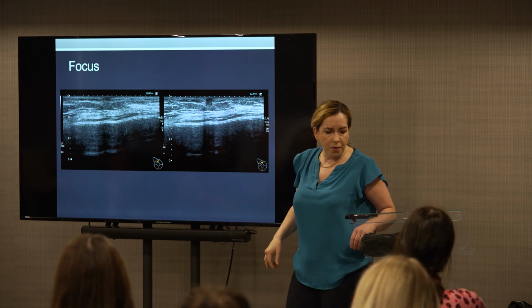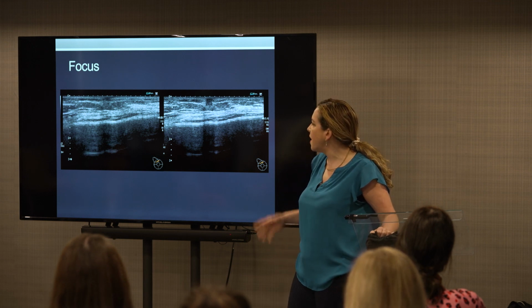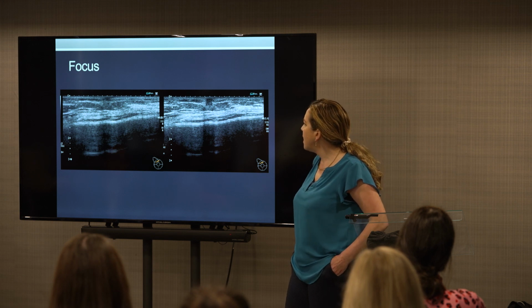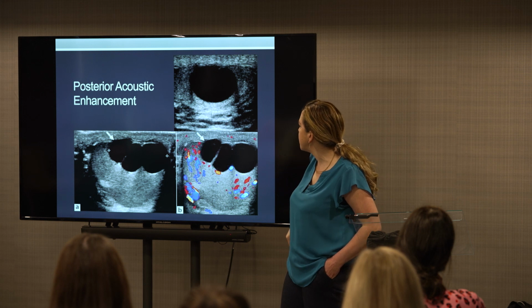So if your machine does have a focus, I would use it every time. You change it a lot depending on what you're looking at. Okay, next image. None of the other parameters were changed, just the focus.